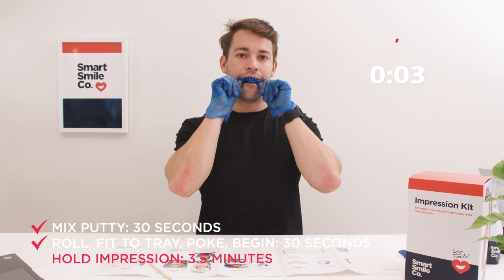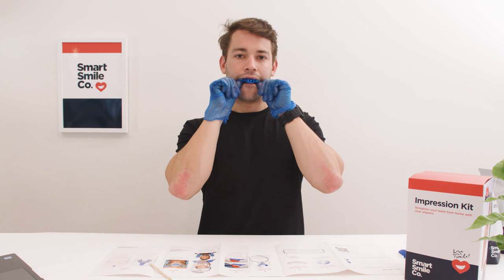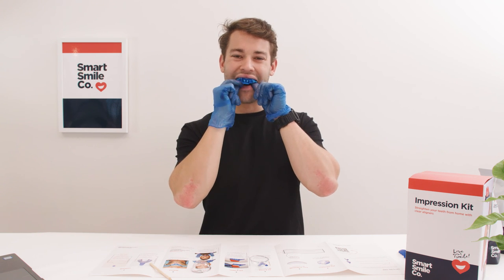3, 2, 1. It's ready. Gently remove the impression using the sides of the tray.